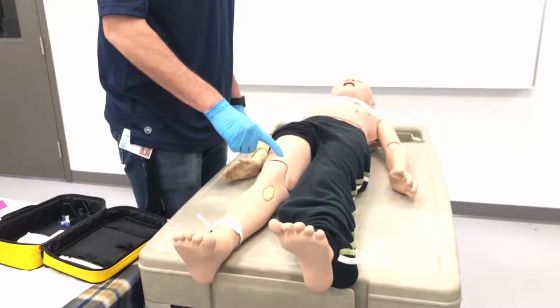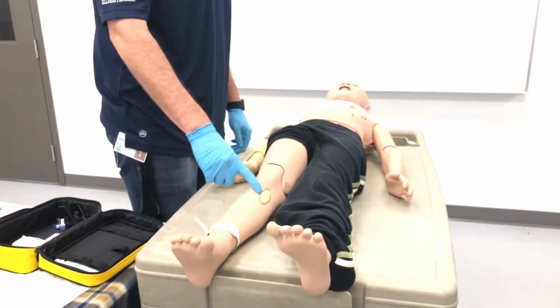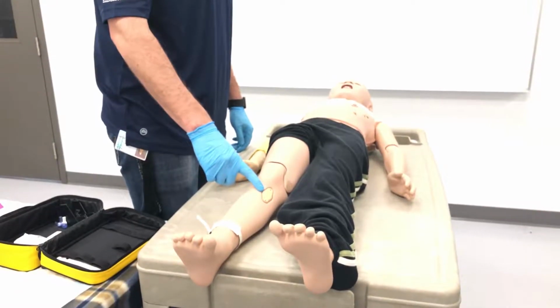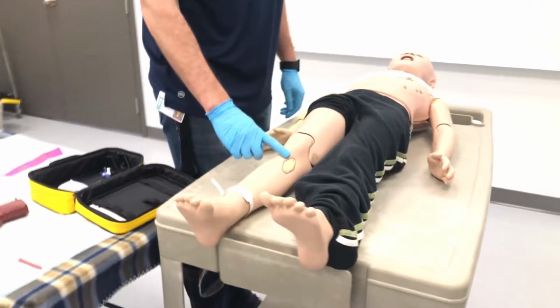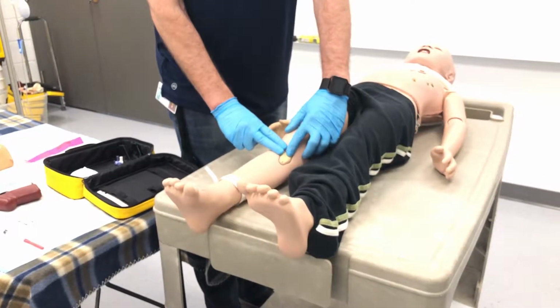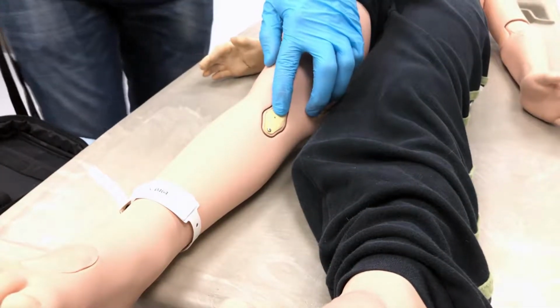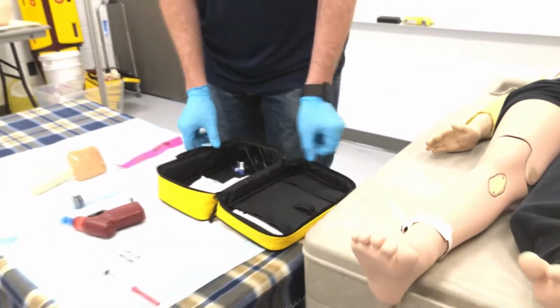For the purposes of this skill station, the student will be examined on the proximal tibia insertion site, landmarks correctly using the tibial tuberosity, measuring 2 to 3 fingers width below and to the medial side of the tibia. Prepares the site using institutional protocol or policy, circling outwards.